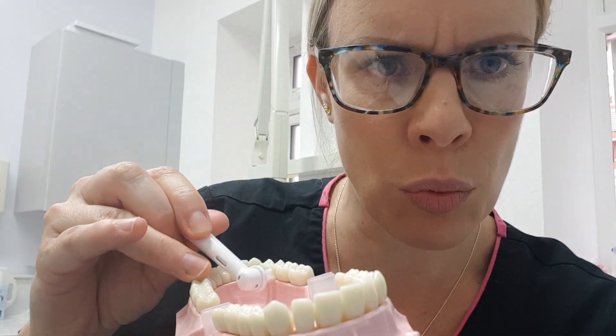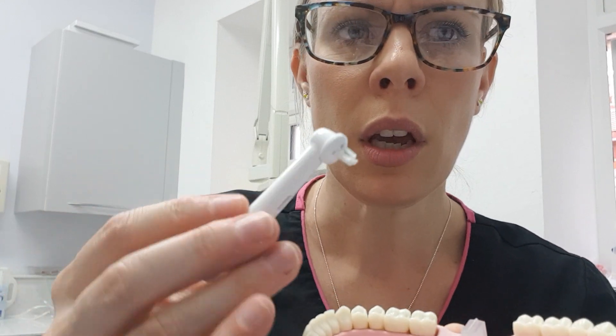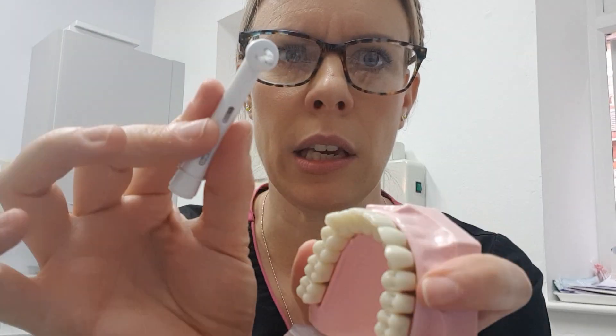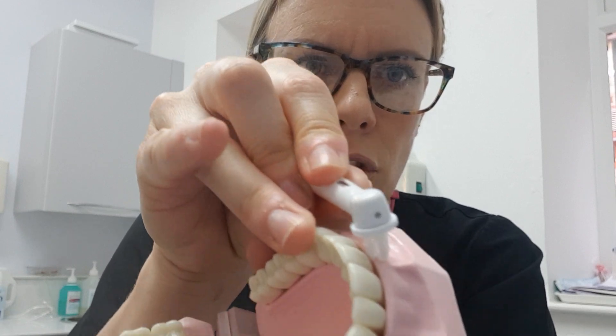Especially if you have a gag reflex, you want the smallest head possible. They're also quite useful around crown and bridge junctions. If you have a crown and it's a bit inflamed where the crown goes under the gum slightly, you can dip it in a bit of salty water or Corsodyl gel and just work it into the junction between the crown and the gum. You don't want to be too gentle — you want to splay the bristles under the gum. So you split the bristles apart; don't just tickle on top.